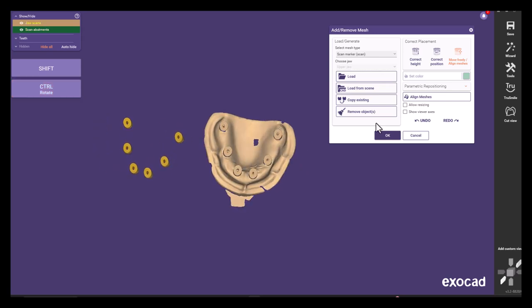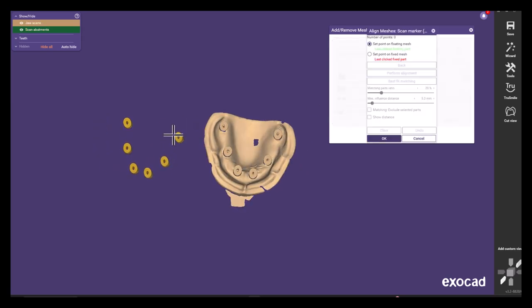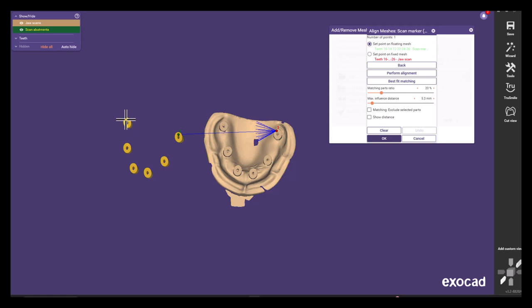Press align meshes afterwards and select a few corresponding points on MicronMapper output and intraoral scan.